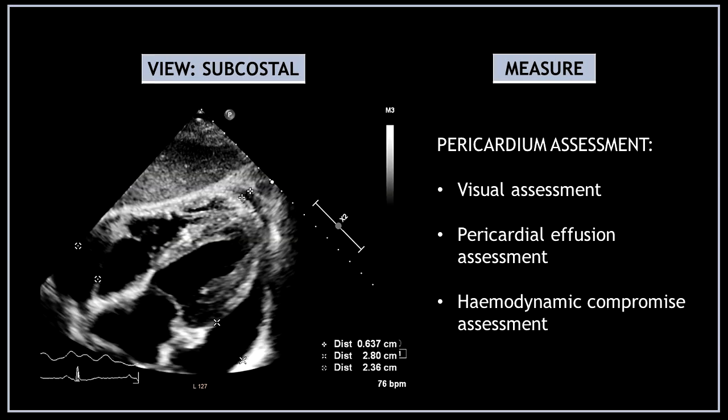Now continue with the pericardial assessment and perform a visual assessment of the pericardium. If you find a pericardial effusion, measure the diameter and check for any hemodynamic compromise.